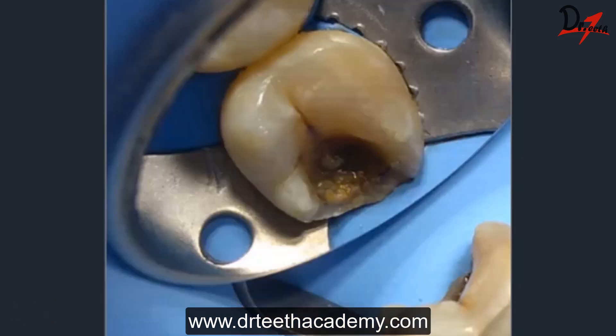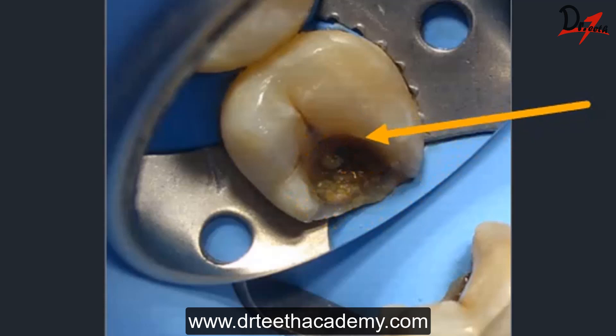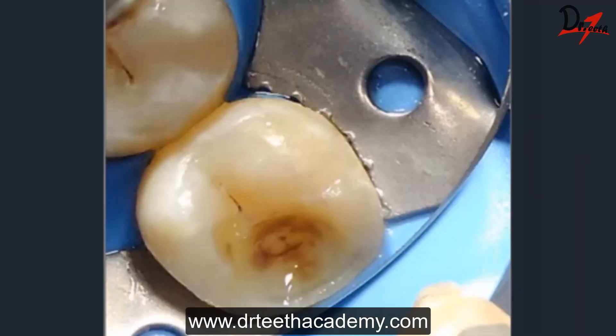Here you can see the cavitated area. You might be wondering where the gingival overgrowth went — I did not cut that gingival part because I was afraid of excessive bleeding. Instead, I selected a thick, heavy rubber dam sheet and tucked that gingival overgrowth underneath the rubber dam, and then I started the caries excavation process.